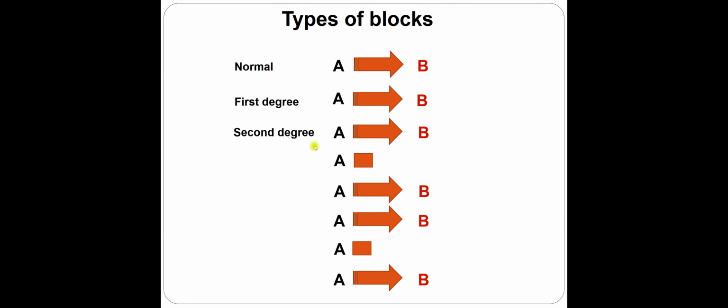Now, the second degree by definition means you cannot have more than only one dropped beat between two conducted ones. So you cannot have two unconducted: not conducted, not conducted, conducted, not conducted, not conducted, conducted. This is not a second degree. Only second degree is conducted, conducted, not conducted, conducted, conducted, not conducted. So that's the meaning, all right? Is it clear? Yes. Good.